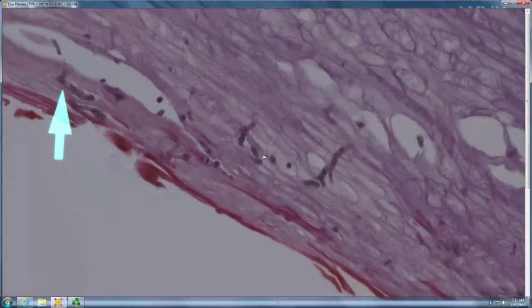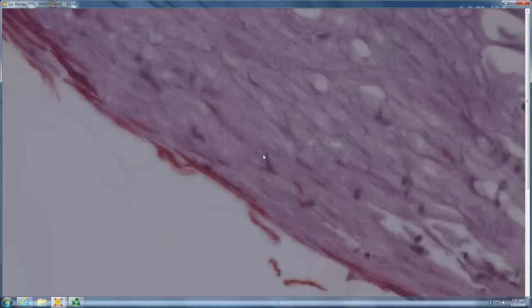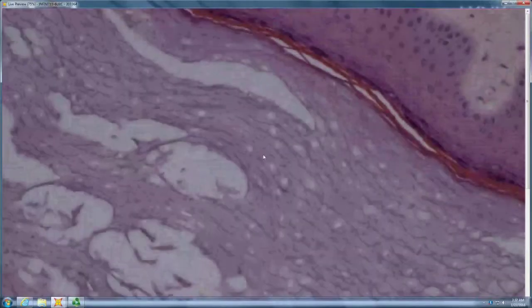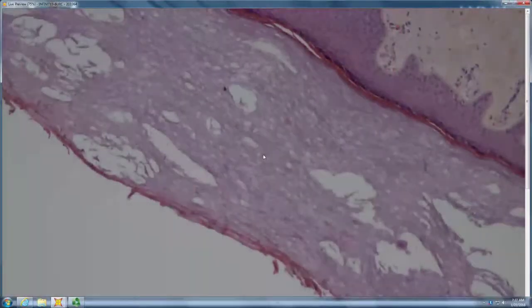Colorless. And this, can you make out a little bit of brown? Yeah. So if those are brown hyphae in a fairly thick scale, I think like tinea nigra. Tinea nigra, exactly. So one of the clues is look at where you are anatomically. It's not really a Candida site, it's a volar acral site.